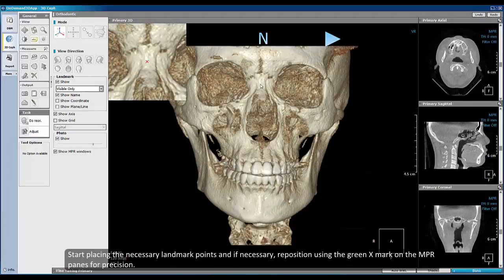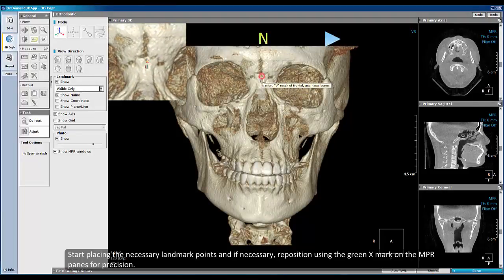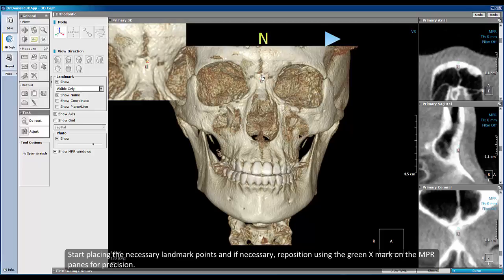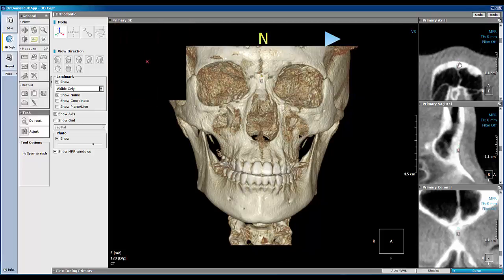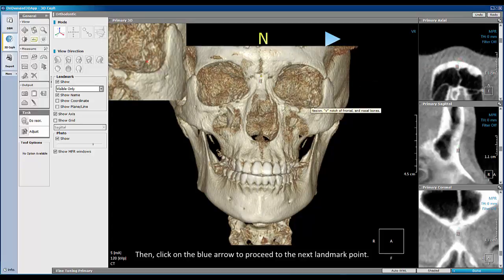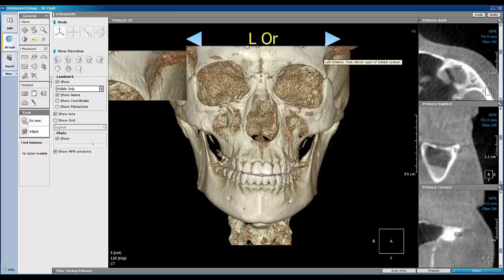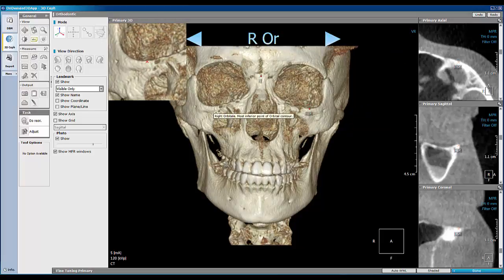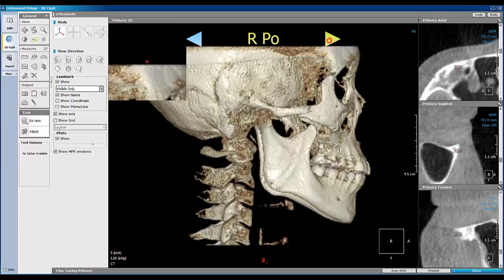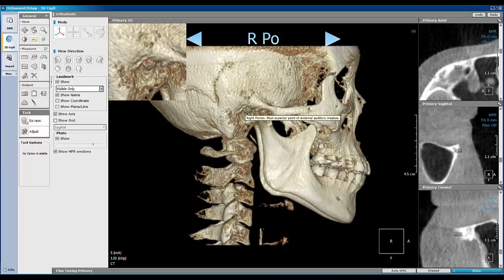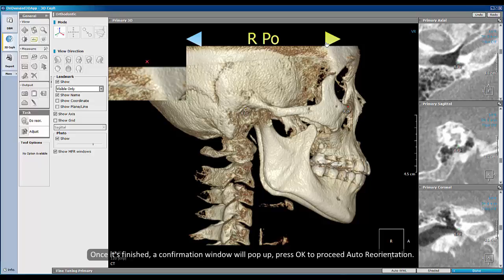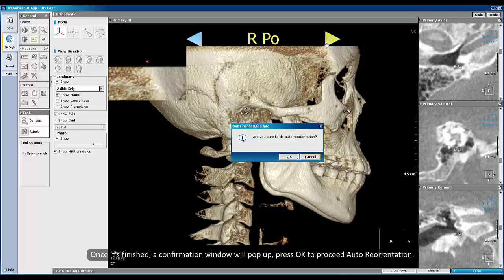Start placing the necessary landmark points, and if necessary, reposition using the green X mark on the MPR pane for precision. Then click on the blue arrow to proceed to the next landmark point. Once it is finished, a confirmation window will pop up. Press OK to proceed with auto-reorientation.